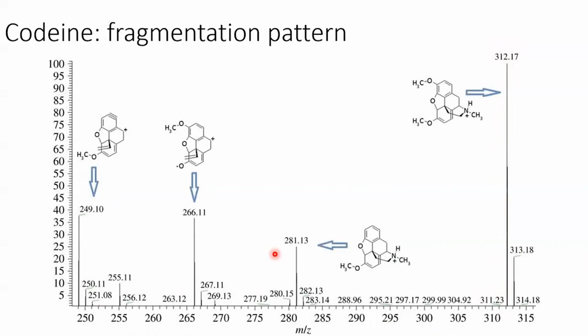So one way around that, if we are sticking with a low resolution instrument, so this is doubtless a more modern low resolution mass spectrometer, we have 2 decimal places to work with. That's still not enough to unambiguously figure out what a molecular formula is, but this time we're looking at codeine and it has a fragmentation pattern shown here. Now, our molecular ion peak, which is the last one shown here, is a match for this cationic fragment of codeine, so far so good.